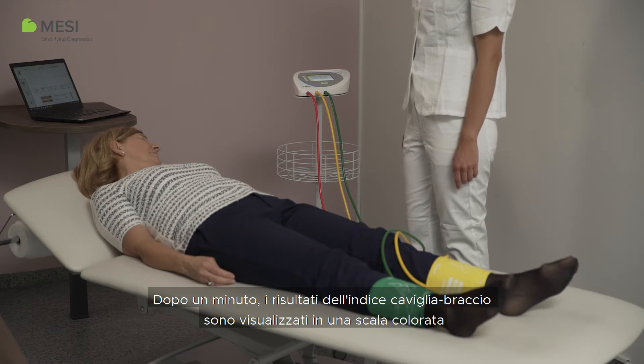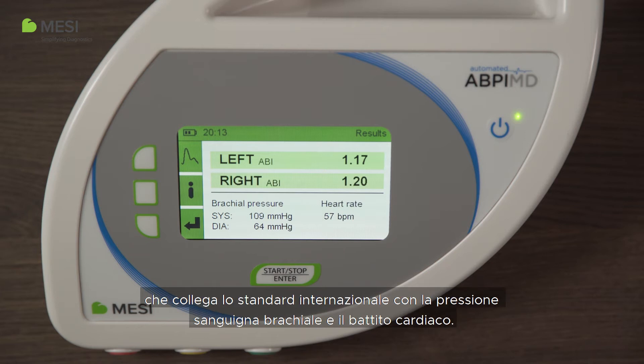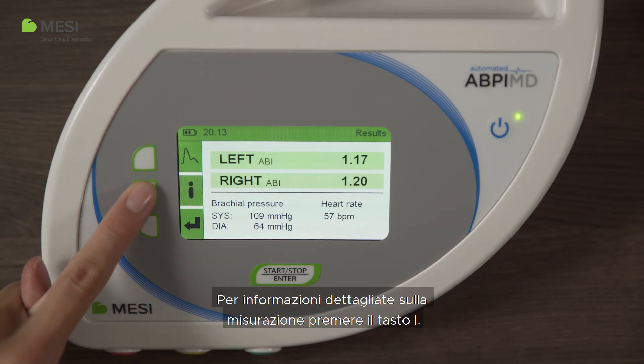After one minute, the ankle brachial index results are displayed in a colored scale that matches the international standard, along with the brachial blood pressure and heart rate. For detailed information about the measurement, press the I button.